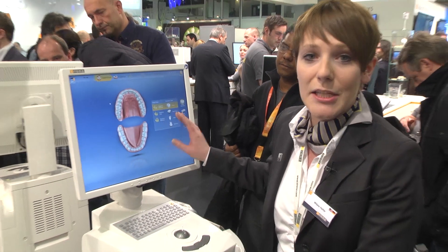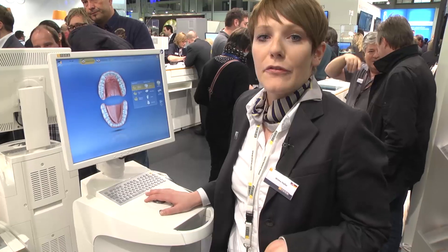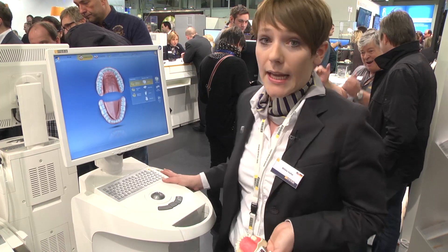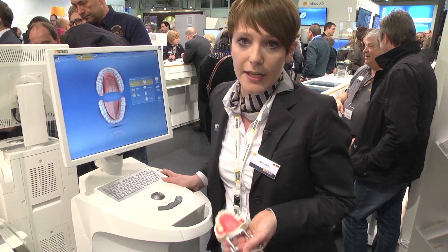Here is the starting point of software 4.2. What's new is that we can now do abutments chairside, meaning directly with a patient in only one session. First, I'd like to show you how you can reconstruct a full anatomical crown directly in the patient's mouth using the OmniCam — absolutely powder-free and with colorful video scanning.